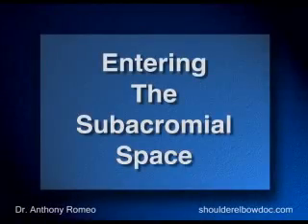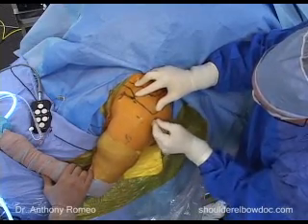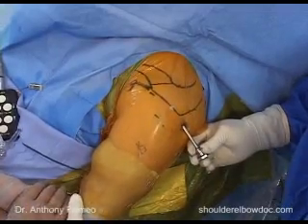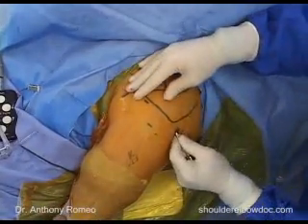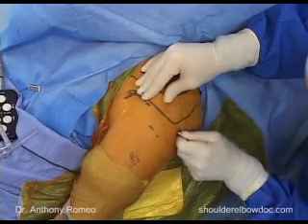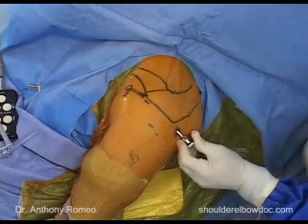We've finished with the glenohumeral joint and now we're going into the subacromial space. We'll go to the back part of the acromion, feel for that edge, and go slightly underneath it. To assist with sliding across without going through the rotator cuff, we'll put a little traction on the arm. We'll stay right on the edge of the acromion, and as we move forward we can feel it pop into place, giving us free mobility in the subacromial bursa.